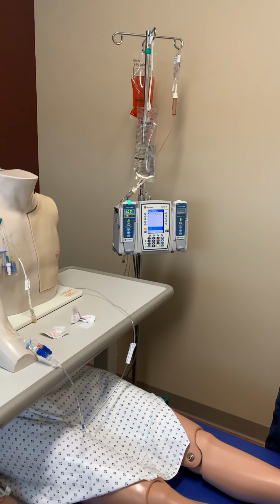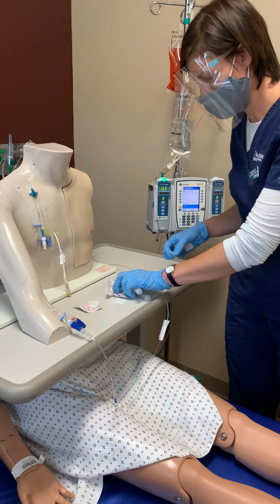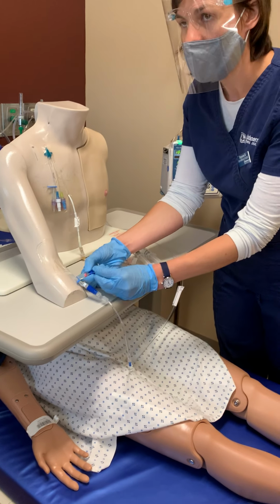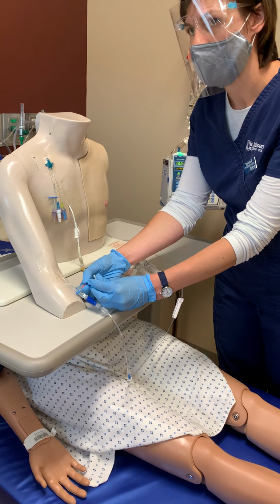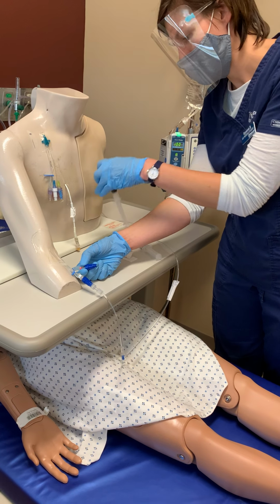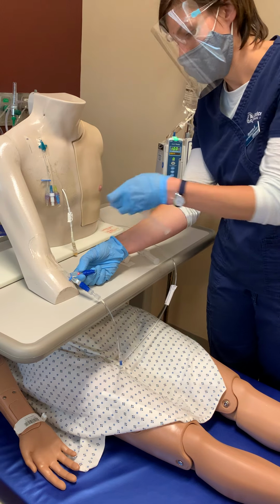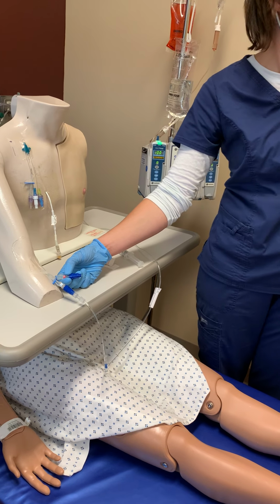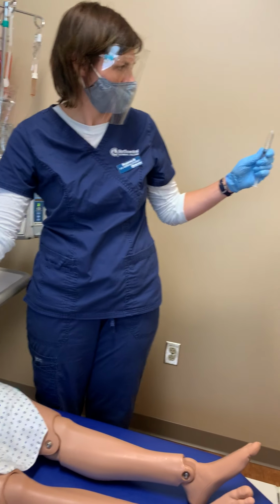One more swab here. Gonna bring these guys over. Again, for 15 seconds. That's my 15 seconds, so I'm gonna let it dry. Another bubble sneaked in there, so I'm not gonna do it over my patient. I'm gonna get that last bubble out.